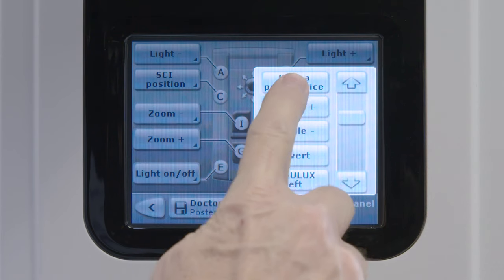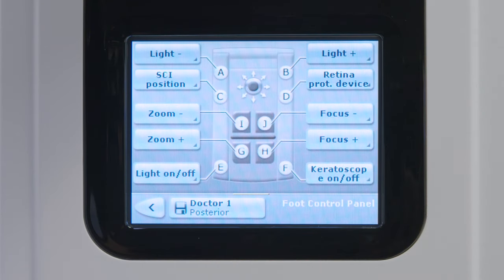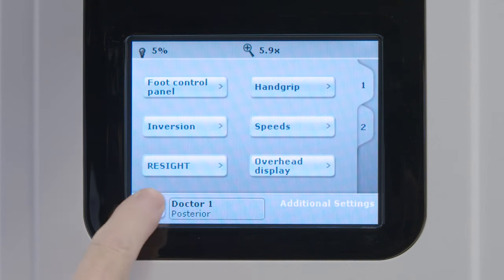Once all switches are changed to the user's preferences, select the Save icon at the bottom of the screen. The icon will have a floppy disk on it with the name of the user and user profile. Select the back button twice to return to the main screen.